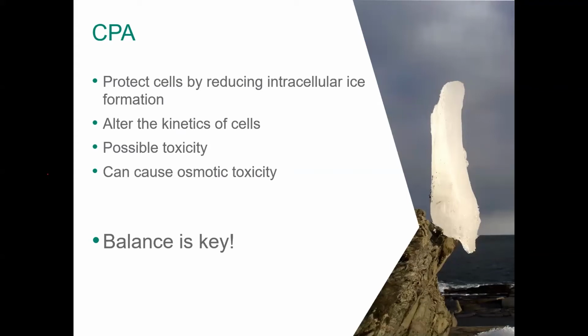So the cryoprotectant, the permeating one, is known to be low molecular weight, and the other kind of cryoprotectant is high molecular weight. The cryoprotectant is used to protect the cells against cryo injury, by replacing the intracellular water. And the non-permeating one is protecting against the osmotic shock. So both of them play a role in protecting the cells from cryo injury and reducing this effect.